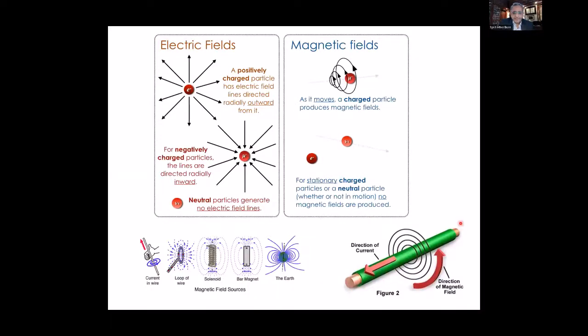So next, coming to the MRI. The CT scan principle is basically electromagnetic waves that are blocked by those structures which do not let that electromagnetic wave pass, just like light. In the MRI, it depends on the magnetic field. We know that all charged particles have an electrical field, right? And we also know that when a charge is moving, it creates a magnetic field around it. That's why an electrical current passing through a copper wire will have a field around it, and we remember all of that from our high school physics.